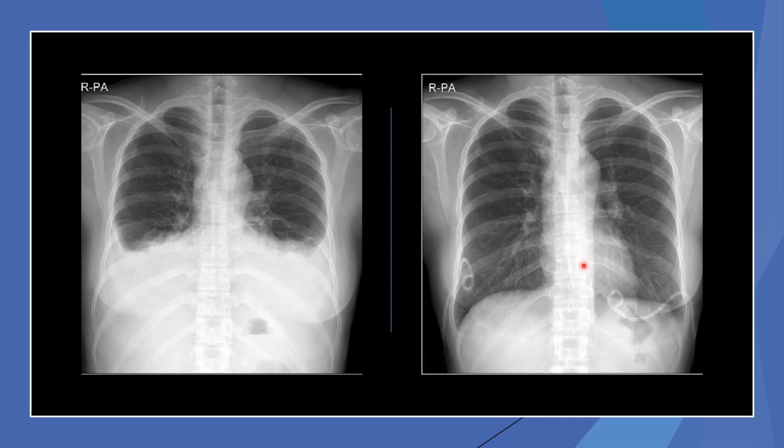All right, so here's a chest x-ray of a pleural effusion. I love this one because this is actually the same patient. So here on the left, we've got this woman with a pleural effusion. And look at this. All of this is fluid accumulation down around the bases of her lungs, both lungs. After they went in, you can see now they've put these small tubes in here. They're down at the base, okay? And that's going to drain that fluid out.